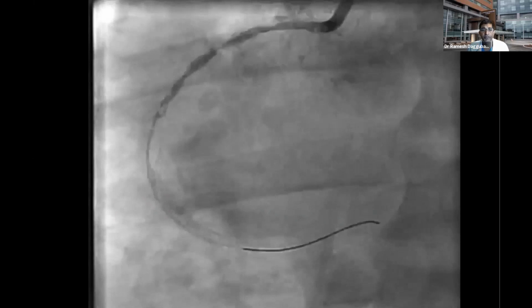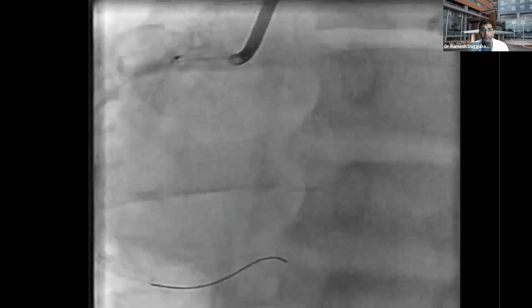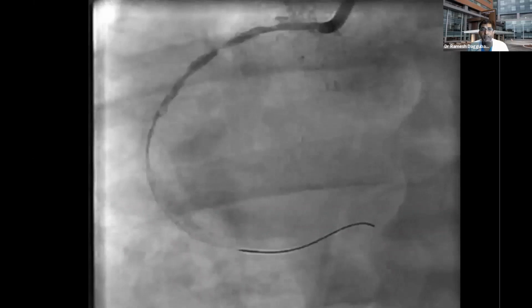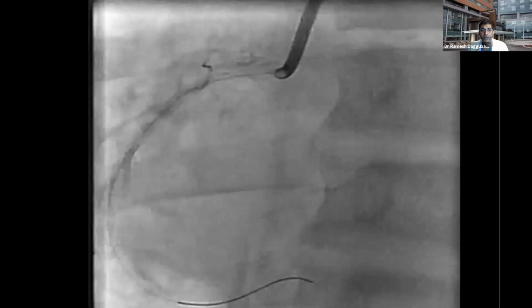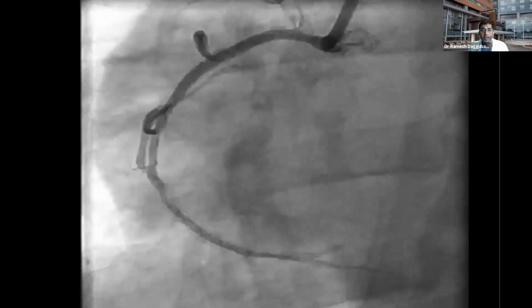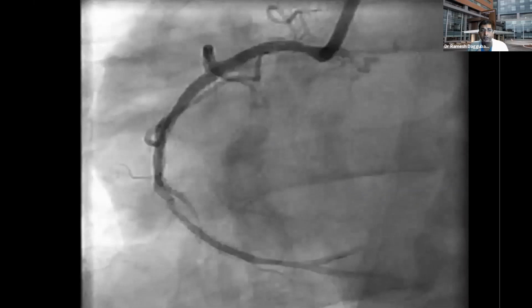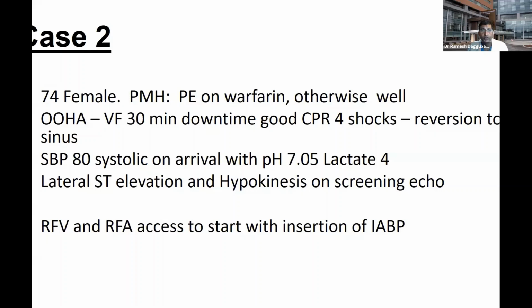Obviously, it's not unusual to expect abrupt vessel closure, because we've been really messing with the entire artery. Now we were able to go back and finish our intervention successfully without any problems. That is still TIMI 3 flow, and the patient was discharged home the next day.